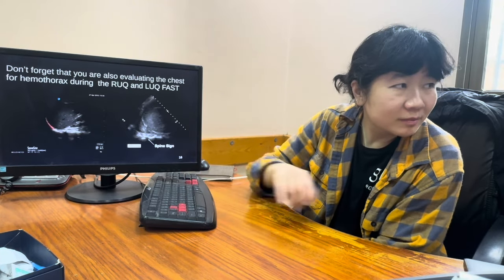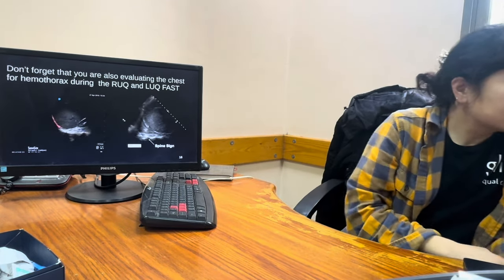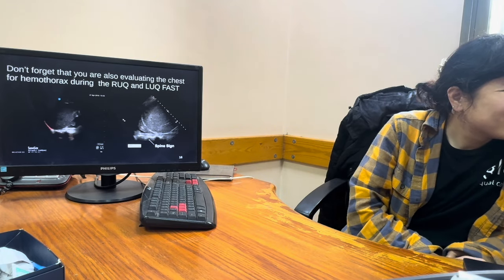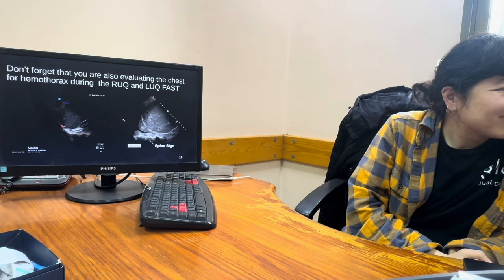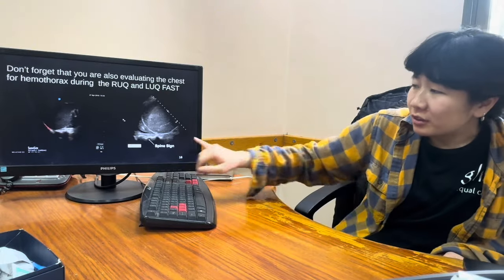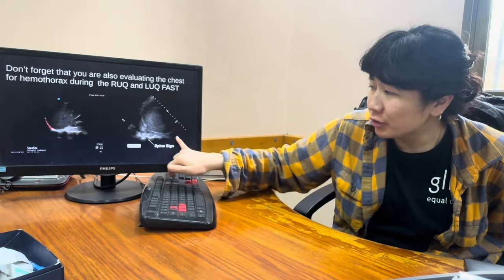Normally, I should not visualize the spine sign. Whenever there is fluid, there is a duplication of the spine, so you can find the spine above the diaphragm. Perfect. So Rowan said this is the spine sign, and she gave the perfect definition for it.